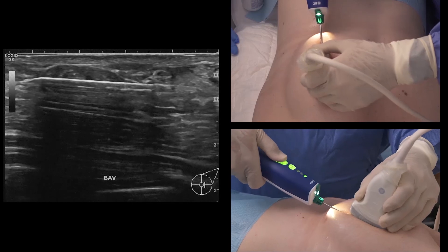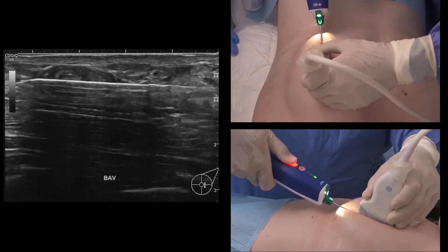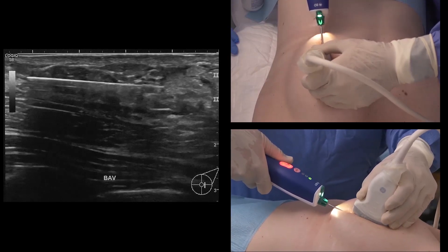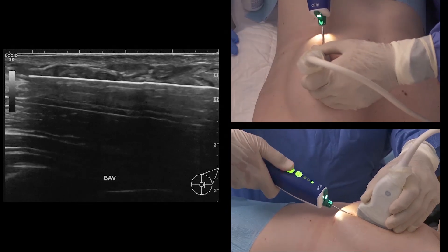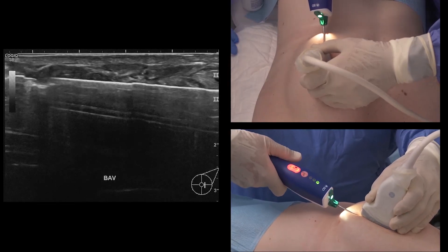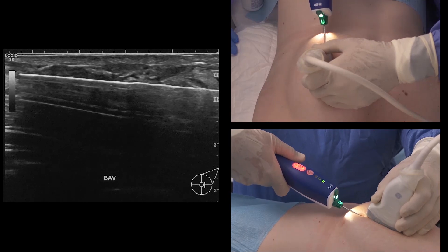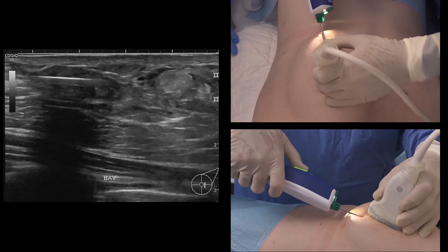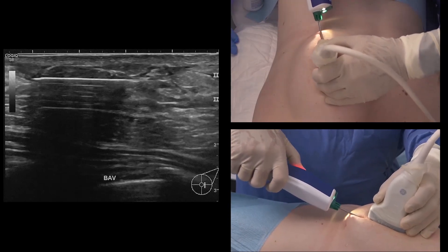Press and release the sampling button for sample collection. Samples are driven to the sample container at the rear of the driver. Simply rotate the driver to direct the notch towards the desired location and press the sampling button to collect each sample. Multiple samples are obtained with one needle insertion.